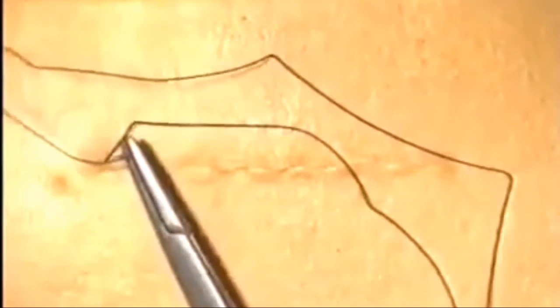At the end of the incision, the needle can be exited about a centimeter away from the edge and then the needle reversed and passed back almost through the same hole in the skin in the opposite direction. This can be repeated, passing the needle through the same skin hole, back again and then cut.